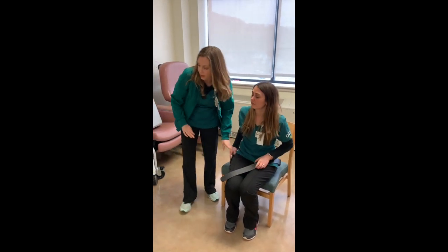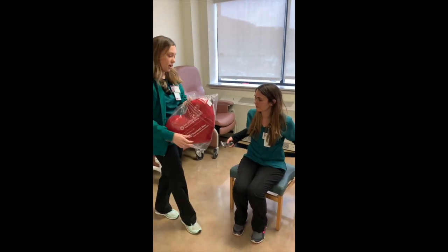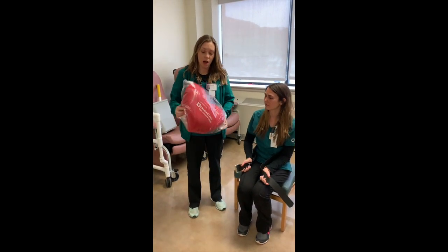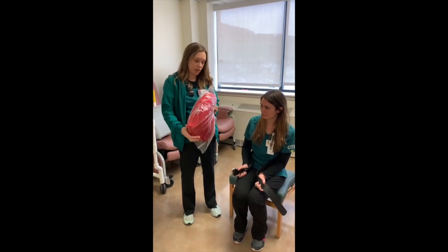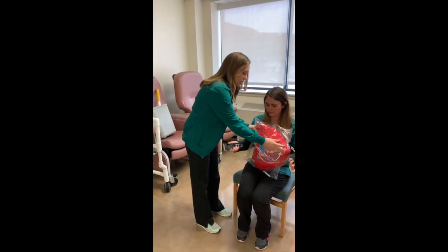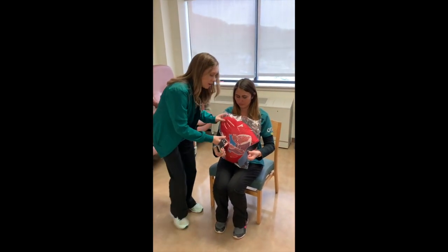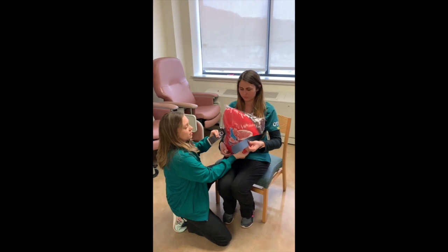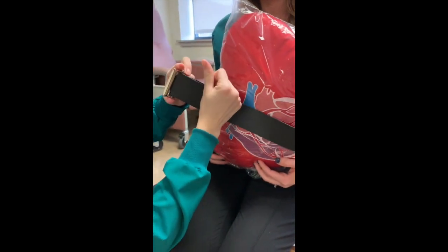So if you're working in the ICU with any of our post-op heart patients, we like to put the heart pillow on the patient in between their chest and the gait belt. So we're gonna bring the heart pillow in, and then you're gonna bring the gait belt up a little bit higher. If you turn the heart pillow sideways like this, the gait belt will stay a little bit easier.